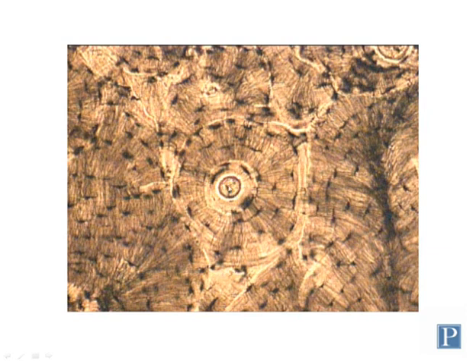Right here in the middle of this osteon is the central canal or Haversian canal. Haversian canal is a name that reflects an older naming system, and so another name for an osteon is a Haversian system. For the purposes of this lab, you should be able to know both terms, and if you're asked to write that on a quiz, you can use either form.